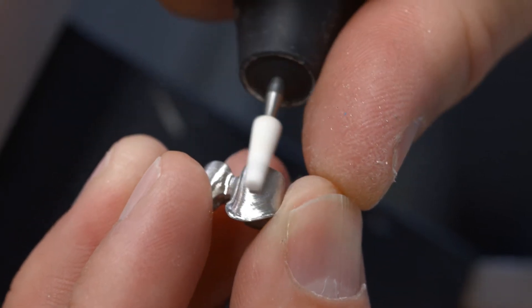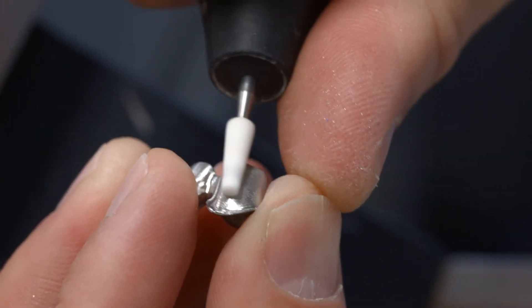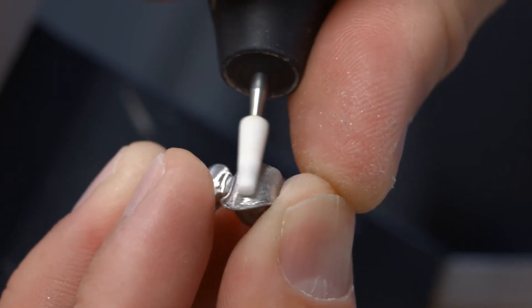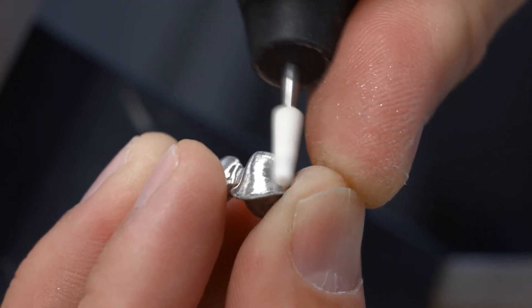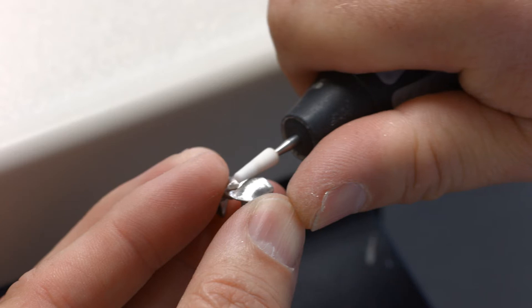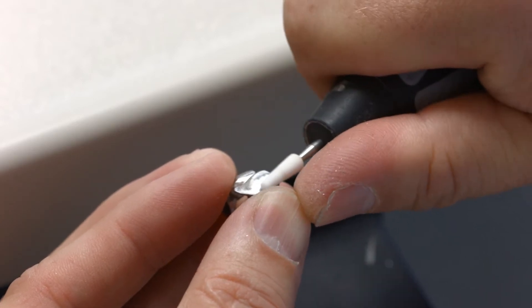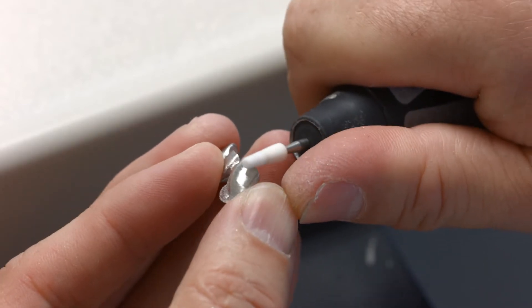Finish the metal framework with tungsten carbide burrs or ceramic bonded grinding instruments. Observe the instructions for use of the corresponding alloy. Work in one direction only to avoid overlapping and inclusions in the metal surface.